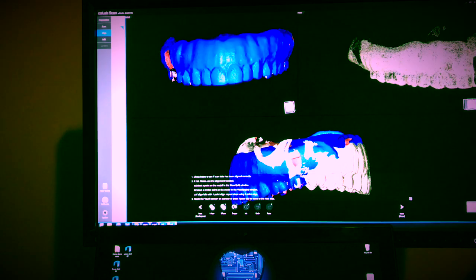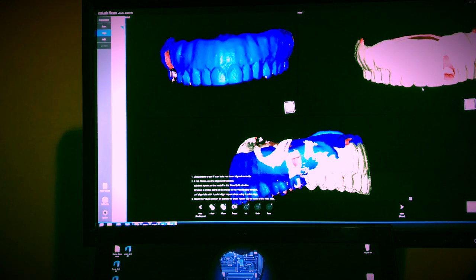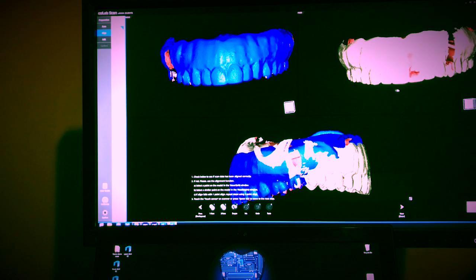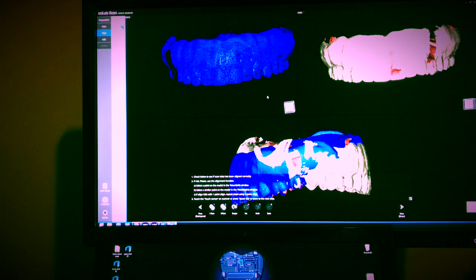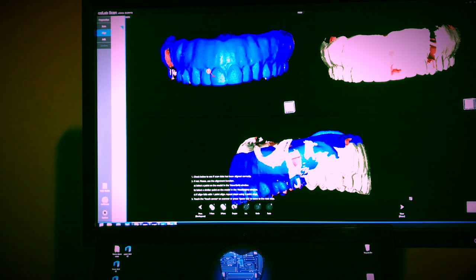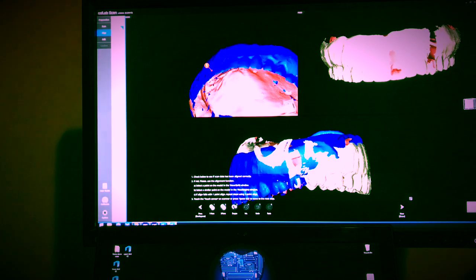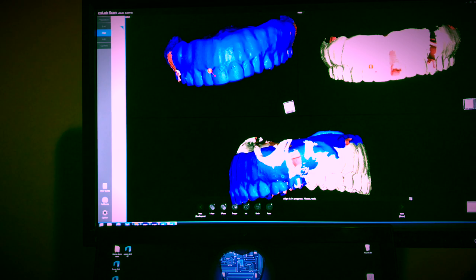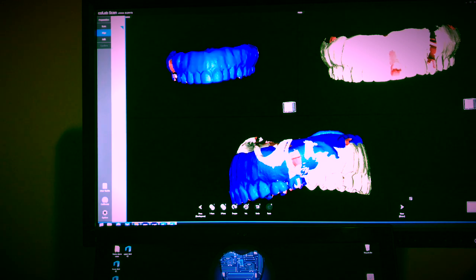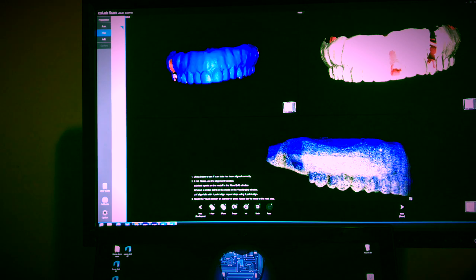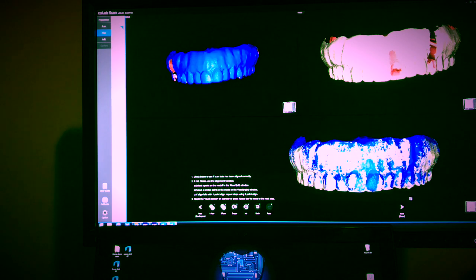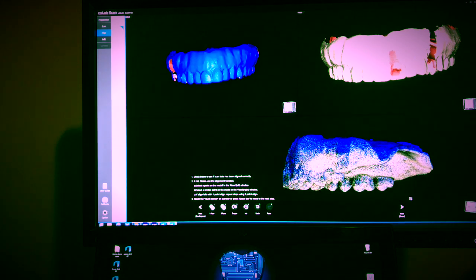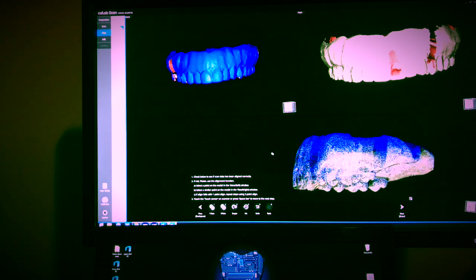Now the software is going to open this window. What you really want to do - the software has artificial intelligence to align similar objects. It's just a matter of selecting one point on the inside and one point on the outside, then you will see right here how things align. That's what you get right there. The alignment is basically perfect. You can see how the blue aligns with the yellow.